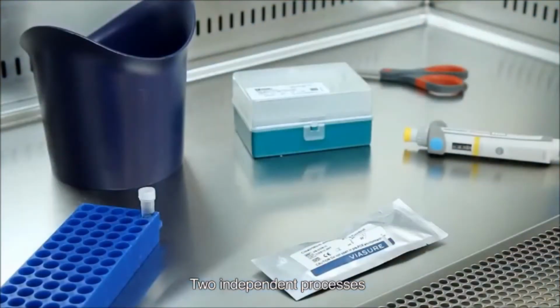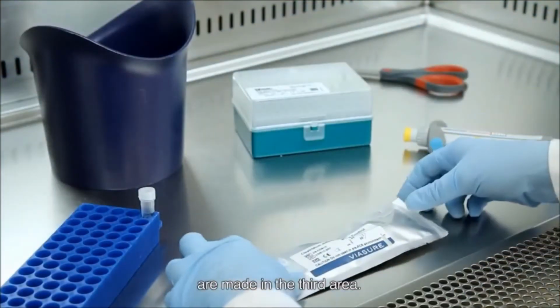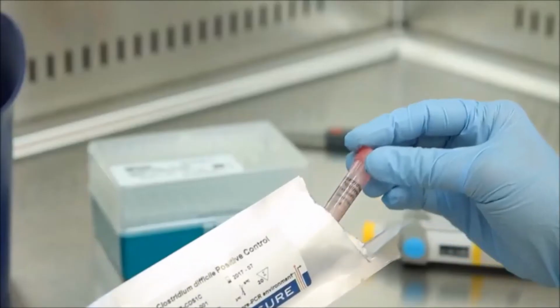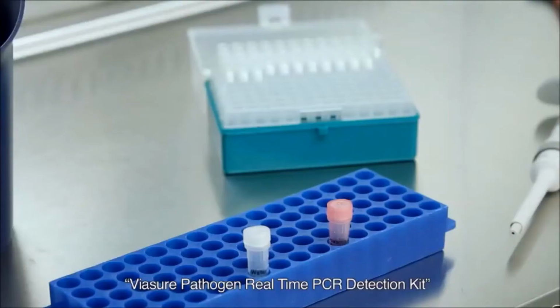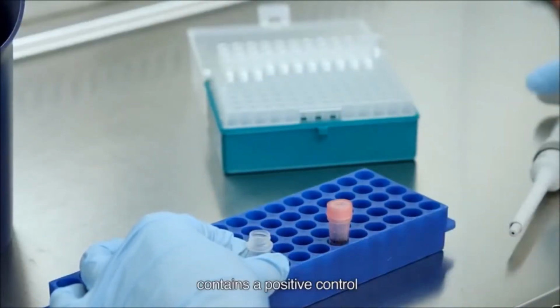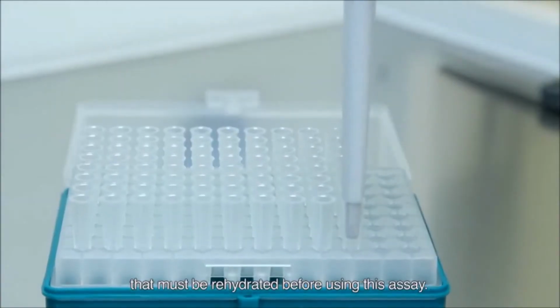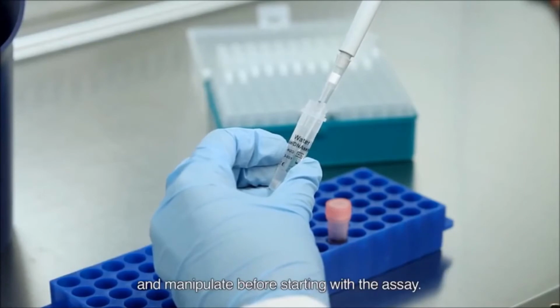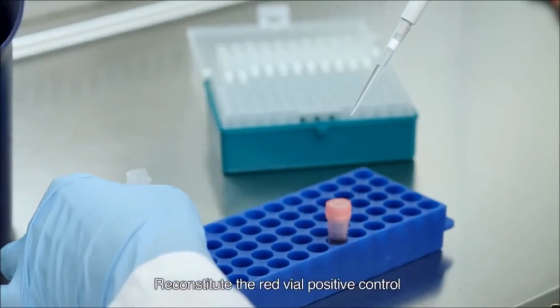Two independent processes are made in the third area. First, the positive control rehydration. ViaSure Pathogen Real-Time PCR Detection Kit contains a positive control that must be rehydrated before using this assay. It is recommended to open and manipulate before starting with the assay.